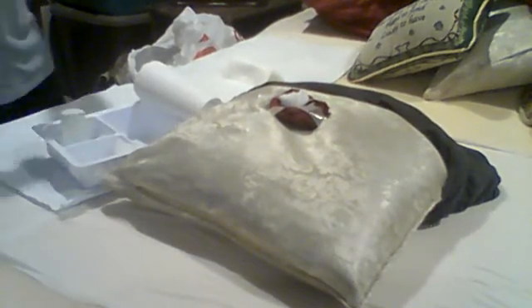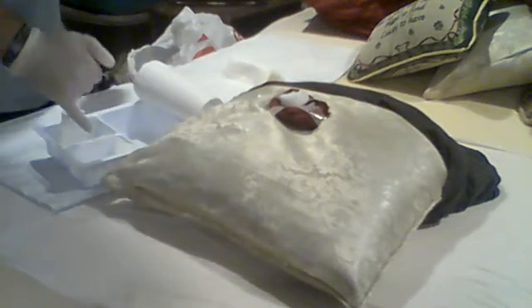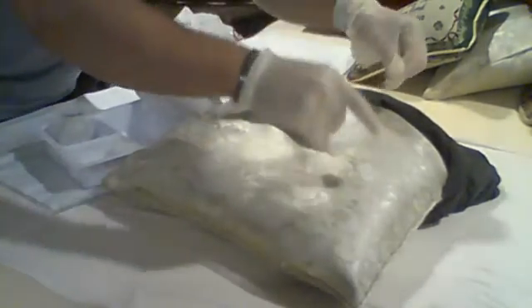Now the next thing that I can do is I'm going to go ahead and apply the dry gauze over the wound. Now earlier, I don't know if you saw, but these are semi-wet. So just a heads up. Without touching the inside of this dressing, because this is sterile, I would apply it, and then I can tape it. I have tape already over here because I didn't want to keep reusing tape and run out of tape.